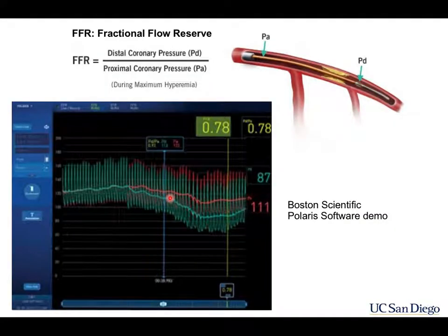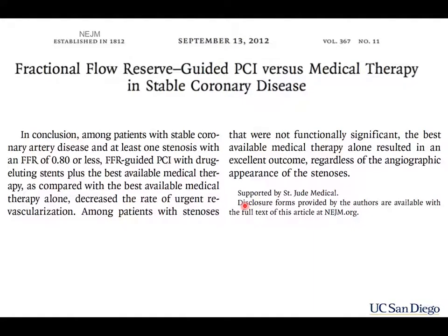And remember this picture? So we're sitting here, you administer the adenosine and you get this change, right? Because the flow demand goes up. So that's the state of the art of what is the gold standard at the end of the day for determining if this patient has significant coronary artery disease.